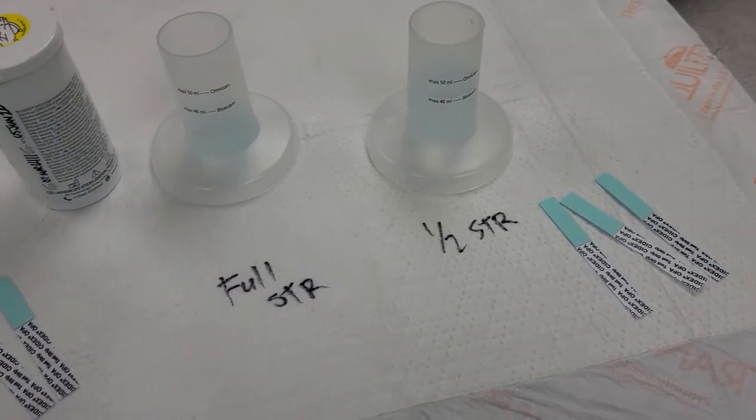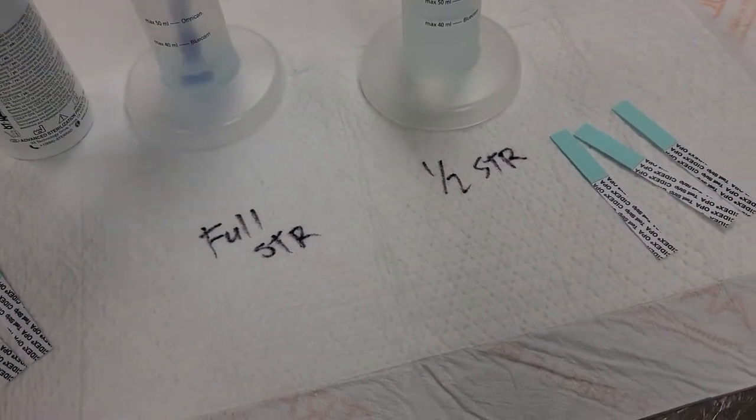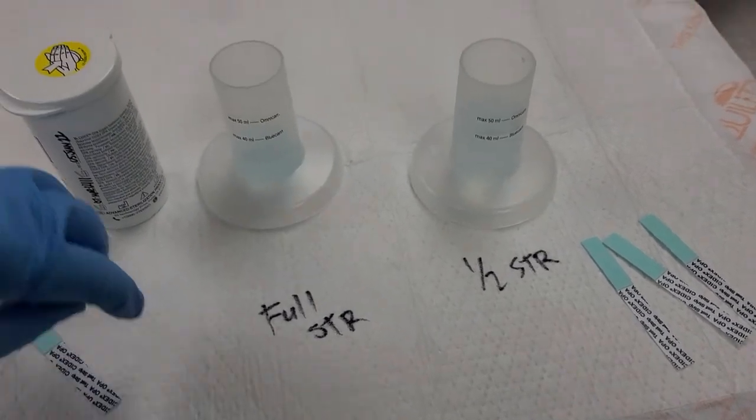Then you're going to take three strips from the Cydex OPA test bottle and you're going to dip each one into its respective container.